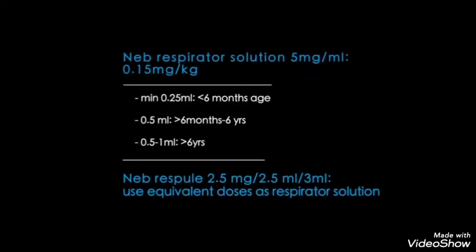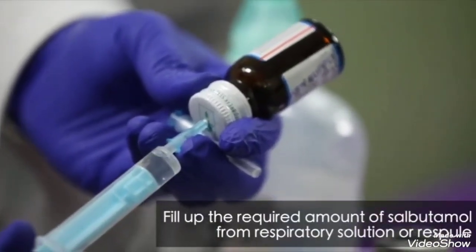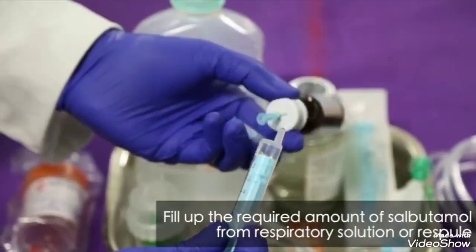The neb respirator solution contains 5 mg of salbutamol per ml. The dosage for administration is 0.15 mg per kg. Taking age into consideration, the administered dosage varies as shown on the screen. For neb Respule, use equivalent doses as respirator solution. Fill up the required amount of salbutamol from respirator solution or Respule.